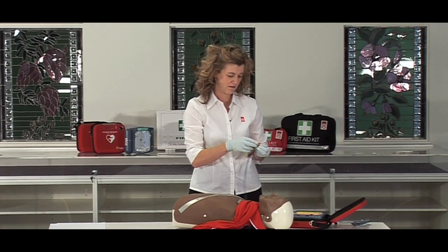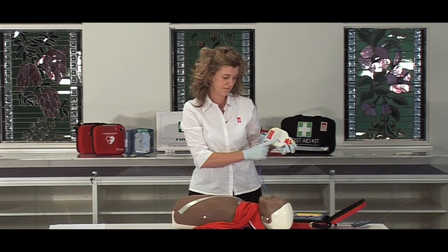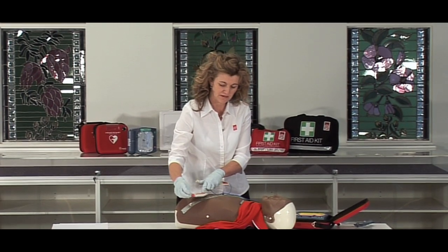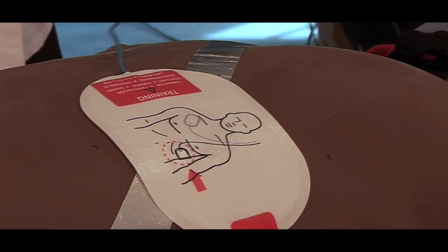Look carefully at the pictures on the white adhesive pads. Peel one pad from the yellow plastic liner — the pads show you exactly where to place them. Press firmly to the patient's bare skin.